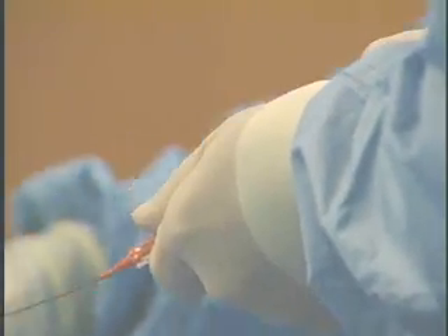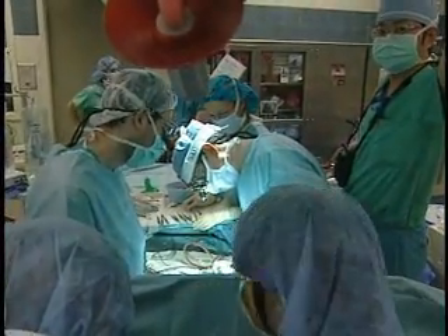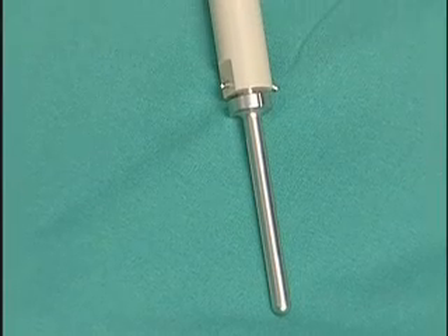But Dr. Joel Mayerson of Ohio State University Medical Center wasn't going to give up that easily. So after removing the bone in Elizabeth's arm during surgery at Columbus Children's Hospital, he implanted this.